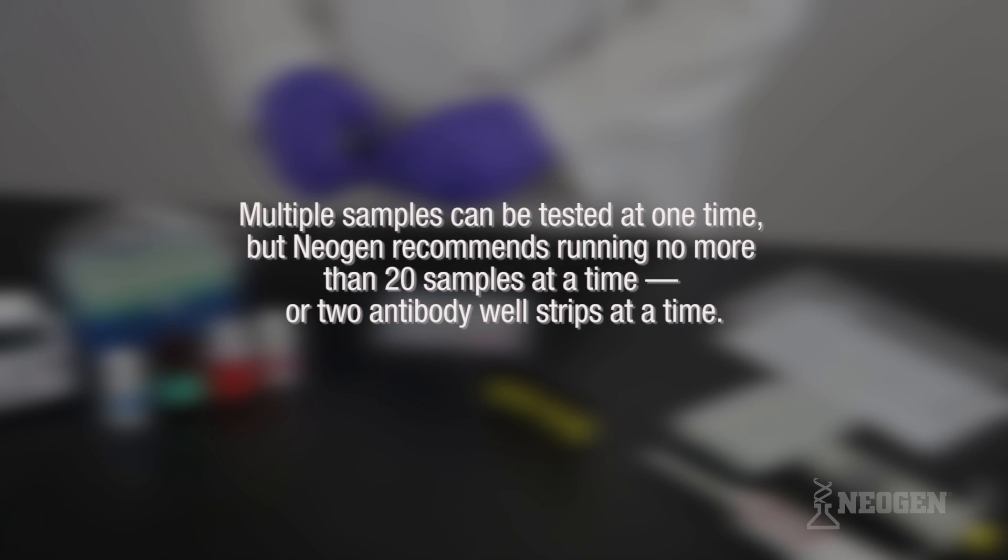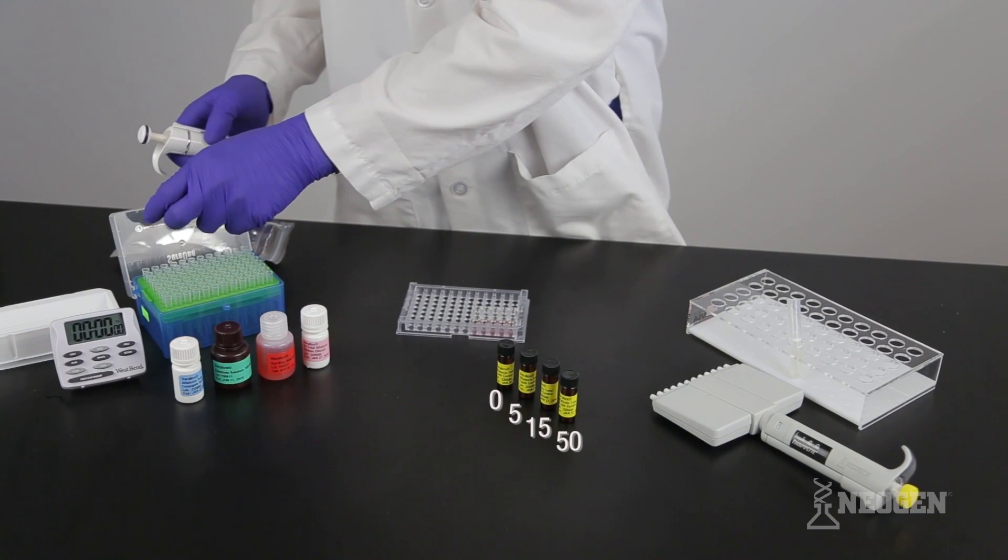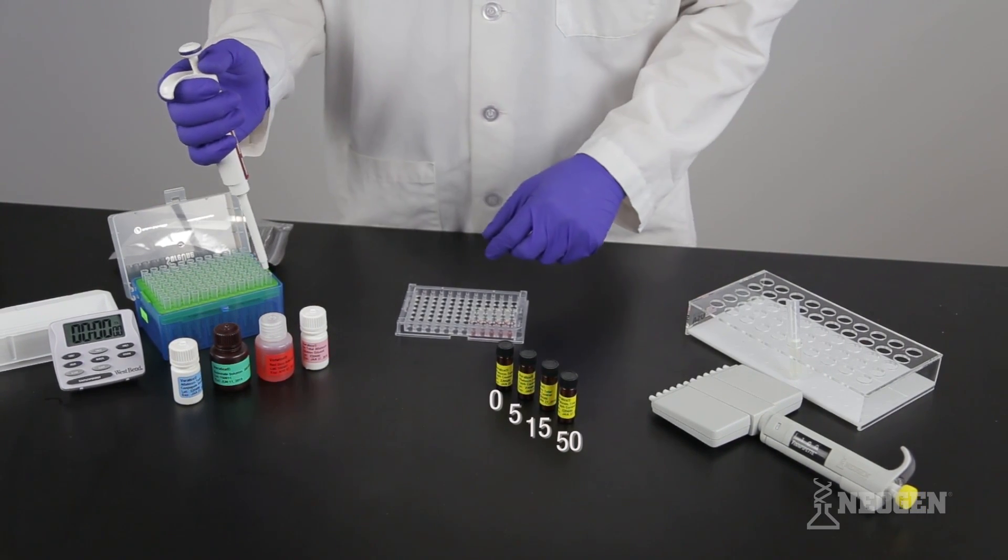Multiple samples can be tested at one time, but Neogen recommends running no more than 20 samples at a time, or two antibody well strips at a time. Put the controls in order from the lowest to the highest concentration.